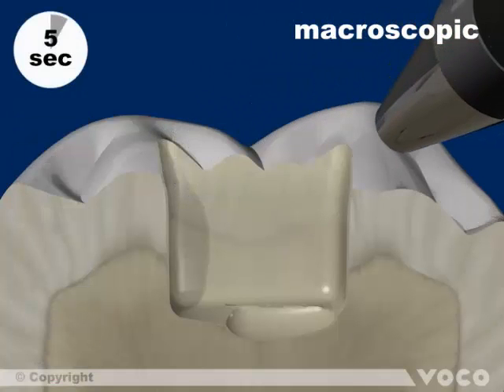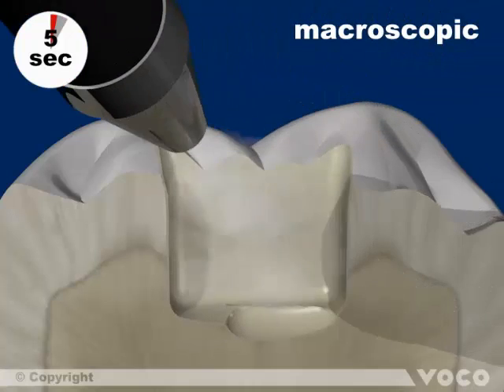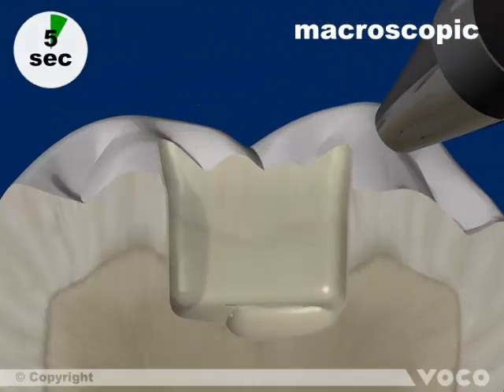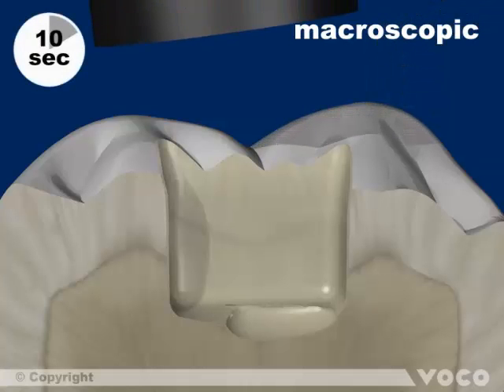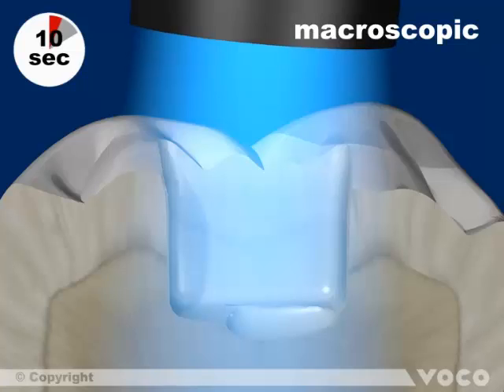Gently air drying, thus evaporating the solvents from the adhesive. Light curing of the adhesive layer for 10 seconds with a minimum of 500 milliwatts per square centimeter.